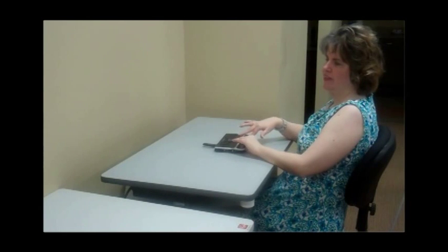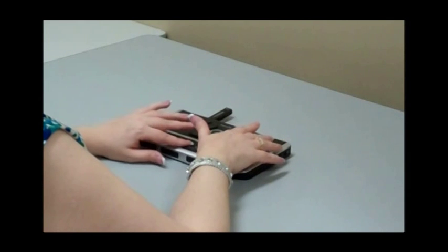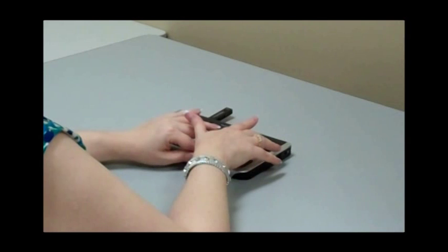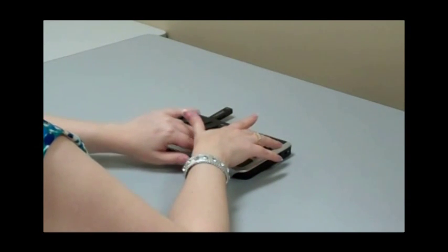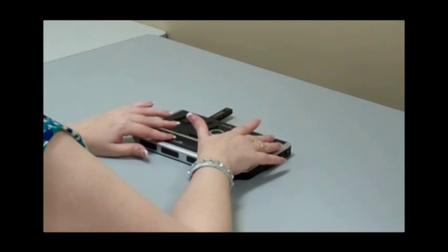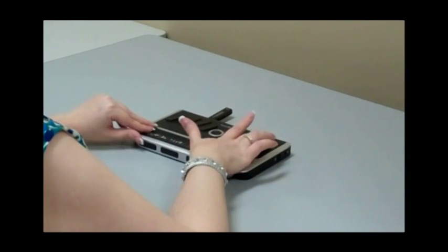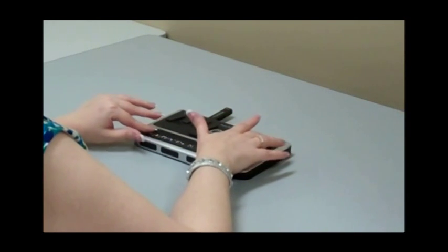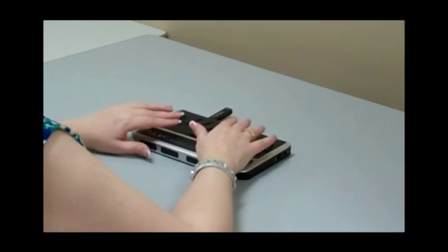Set an alarm on this appointment. Press enter for no. Now, if I wanted to, this is where I could set an alarm, but I'm not going to because I know that it's tonight, and if I can't remember 7 hours from now, there's problems. So we're going to just put set an alarm on this appointment, no. Show time as. Press enter for busy. Show time as, and the default choice there is busy. Mark as private. Press enter for no. Mark as private, we're going to press enter for no. End of list. And then we're at the end of the list.